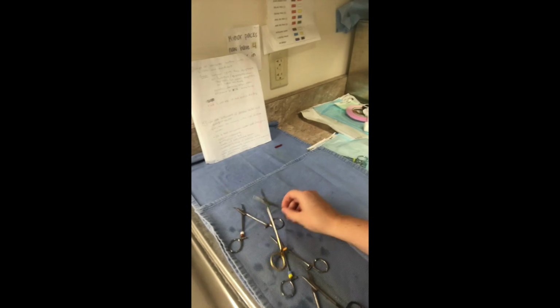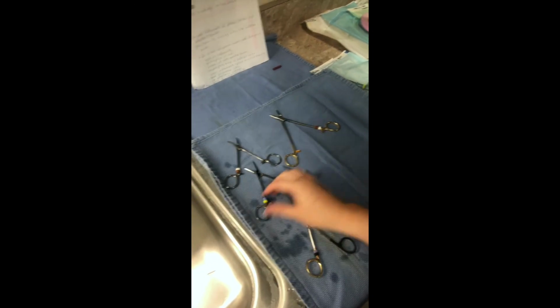So now all of the instruments are opened and on the cloth. We're going to go ahead and put the other end of the cloth over it so they can dry.